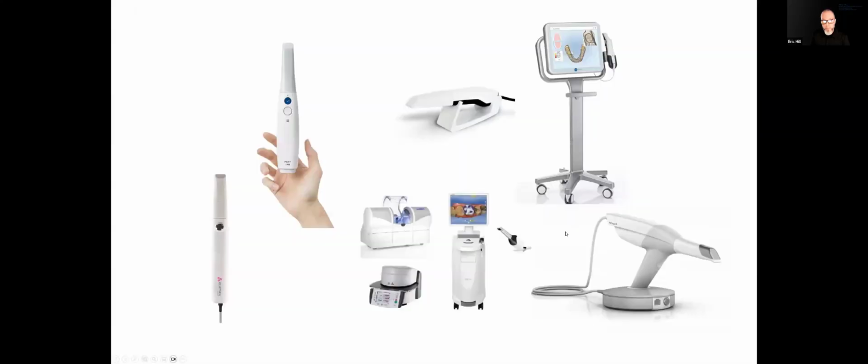Okay, so having said that, all of these scanners are clinically acceptable. You're not going to buy one of these scanners and it's not going to give you good results. They can all give you good results. Even the super cheap ones will give you great results. The difference maker is the training. So if you're not getting good training and you're not shown exactly how to use these things and how to work them in your office, then that's when you get into situations where you're getting bad data.